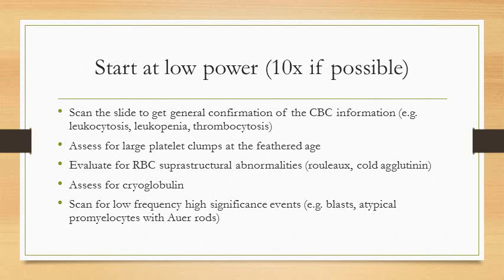And this is another opportunity to catch, if for some reason you didn't verify the identity of the patient, you can catch this error here, hopefully, before you get any further. For example, if the CBC showed a really high white count and you look at the white count on the slide and it looks normal, just make sure you're looking at the right slide.